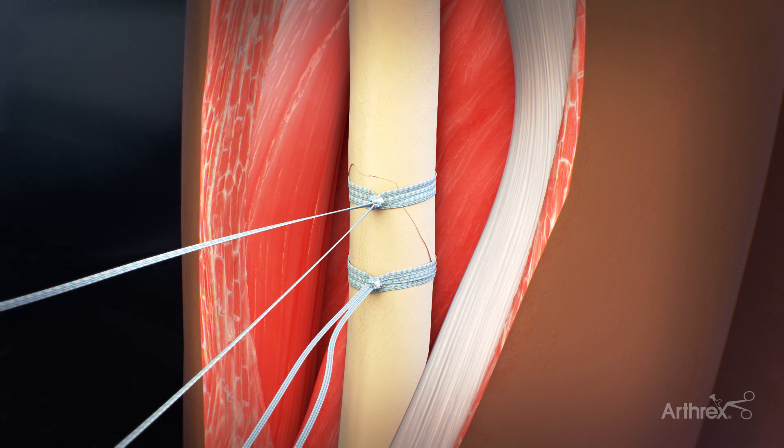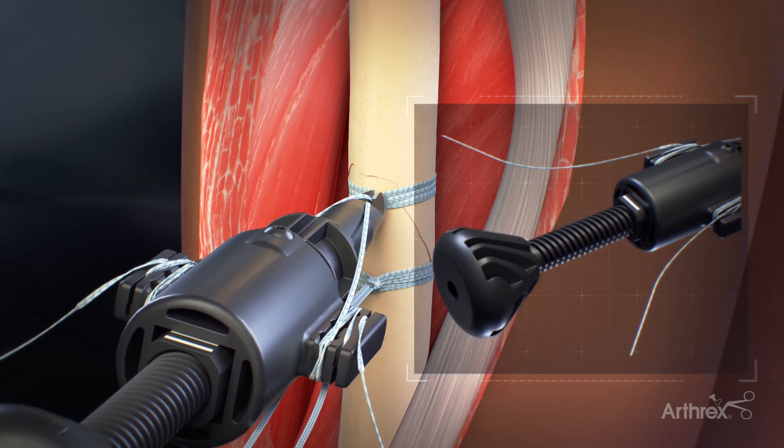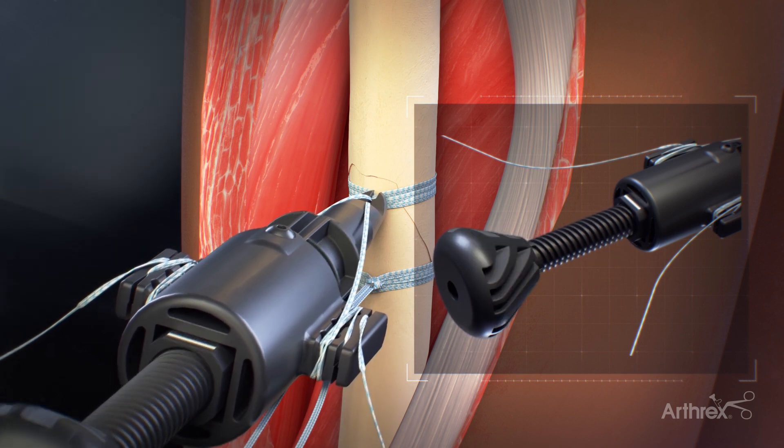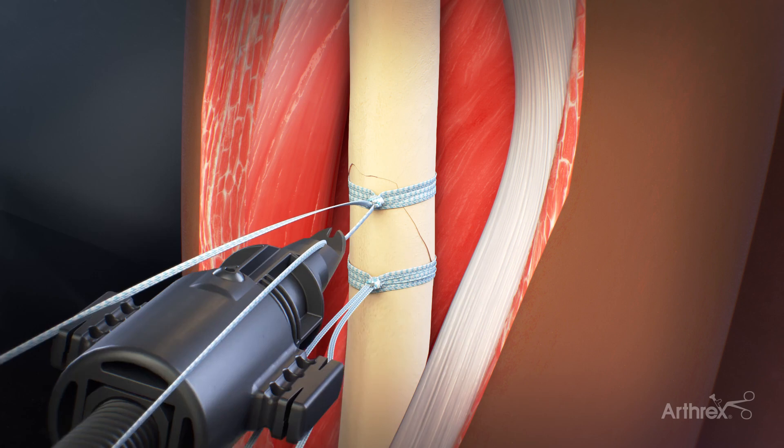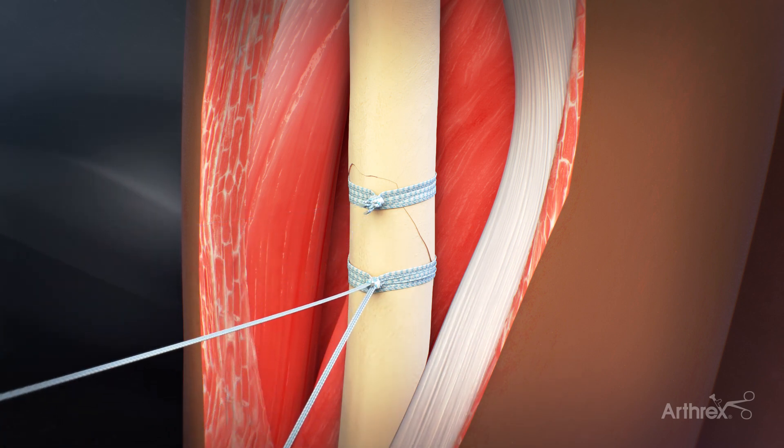After the initial tensioning is performed and the first half hitch is applied, each cerclage may be re-tensioned. The suture limbs are reloaded into the tensioner and the cerclage is tensioned to the desired tension. Two alternating half hitches are tied and the suture limbs are cut.